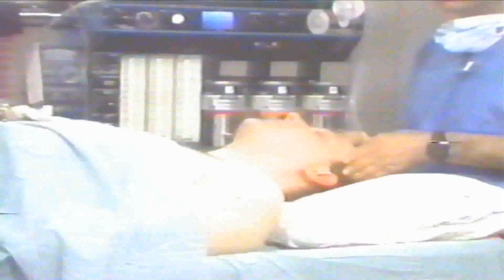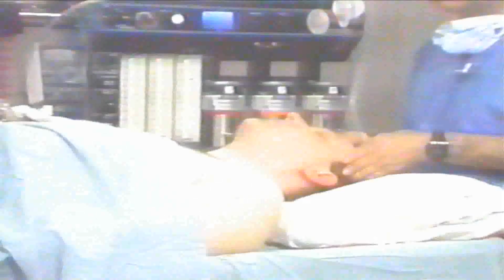For oral intubation during induction of anesthesia, patient needs to be oxygenated with 100% oxygen by placing the mask over the face. The mask covers the nose and the mouth, and the flow rate of oxygen must be more than minute volume of the patient. Minute volume of average patient is 6 liters per minute, so flow rate should be between 8 to 10 liters per minute.